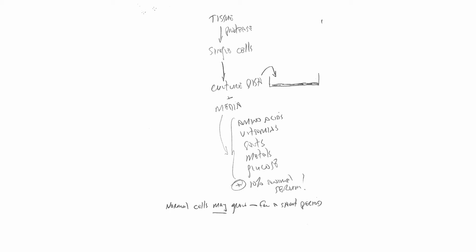And generally, the way it's been done over the years is the animal that's used is cows. And the way those are obtained is there are industries that are connected with the cattle industry, meat processing, and they drain the blood, and then they use that to prepare this animal serum. Sometimes horse serum is used. The serum is what's left after the blood clots. So if you take the total red blood, put it into a tube, and let that clot form, and you remove that clot, the yellowish liquid is the serum.